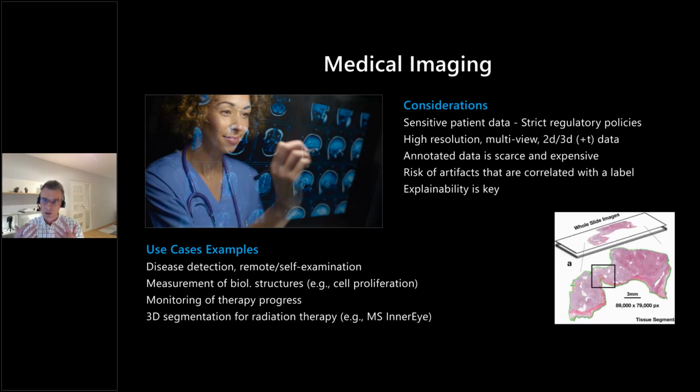For a prediction, you combine, for example, a frontal X-ray with a lateral X-ray to get a prediction. So it's not only single images. We are processing multi-view images. And then, of course, we have 2D use cases, yes, but we also have 3D use cases, and sometimes even 4D if we also have a time dimension.